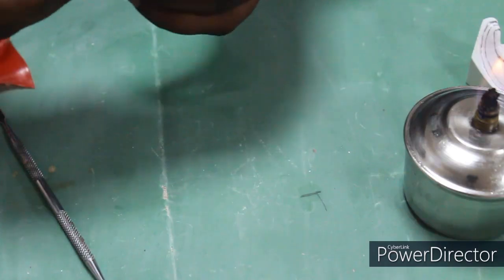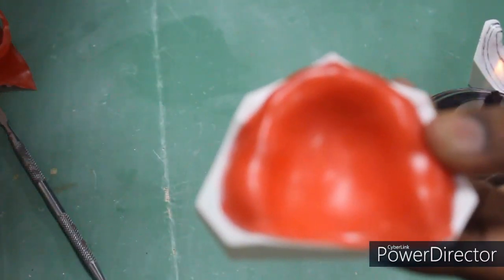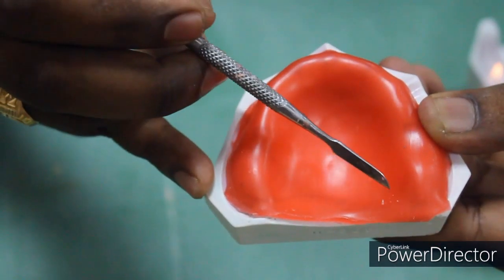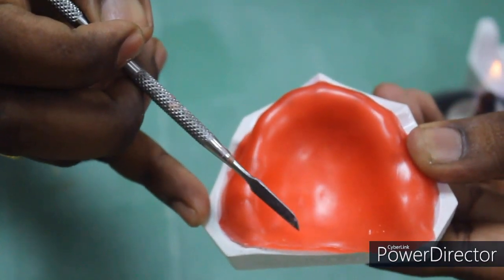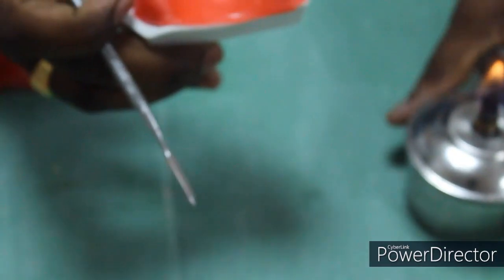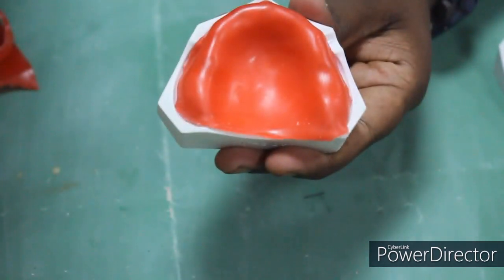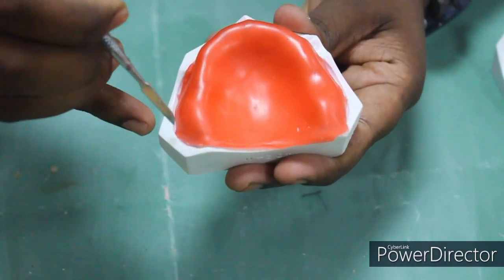After re-adapting, if you closely watch here, you can see the extension line we drew for the spacer through the wax. Using that as a reference, you can remove the excess wax beyond the spacer outline.